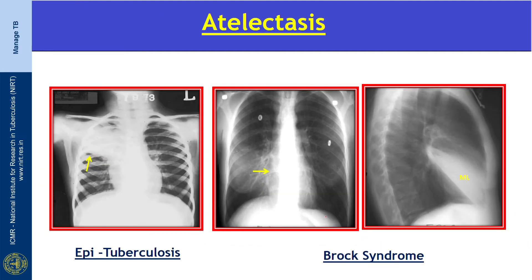Atelectasis is frequently present in primary tuberculosis due to airway compression by adjacent lymphadenopathy or airway stenosis. The atelectasis is most notable in the right upper lobe anterior segment — we call it epituberculosis — and it is also seen in the middle lobe, popularly known as Brock syndrome. This X-ray shows middle lobe collapse with silhouetting of the right cardiac border. The lateral X-ray classically shows a wedge-shaped middle lobe collapse, usually seen in primary pulmonary tuberculosis.